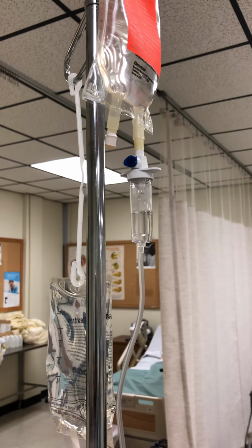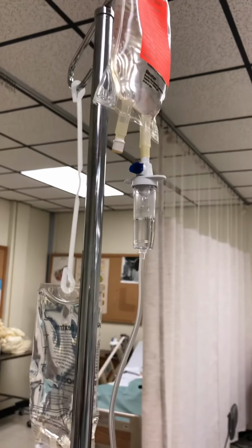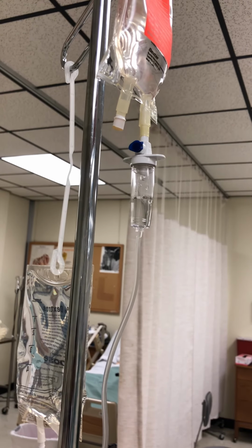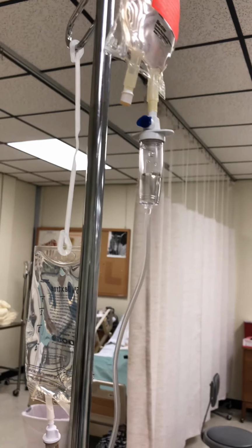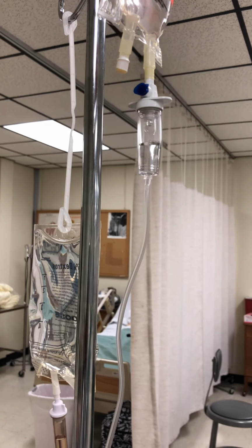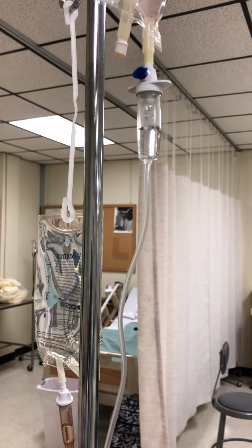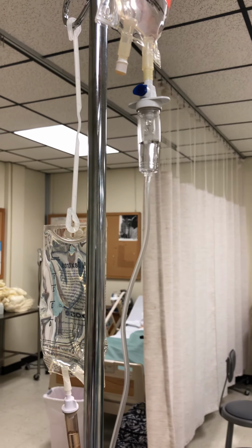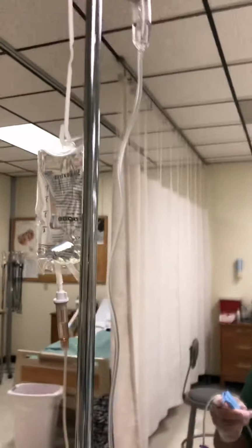Now. We can stop that. Okay, so now we got our drop factor.